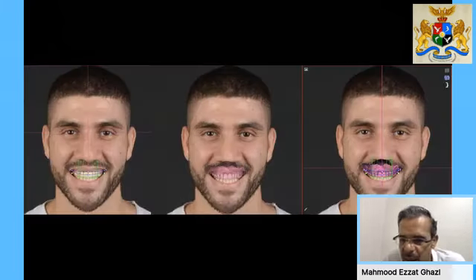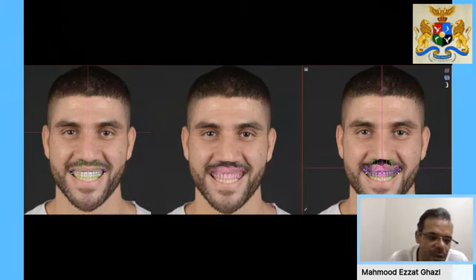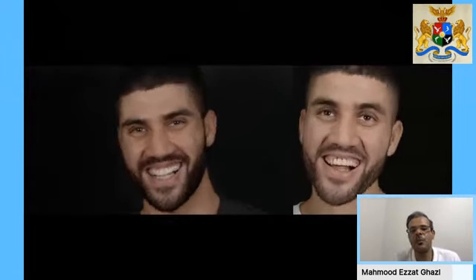Sorry about that. Now you can see with the lines that we have huge deficiencies, of course, again, in the papilla. The crown was totally elongated to try to mask that defect, but of course, it was a terrible job. So from there, we first do a mock-up for our patient.